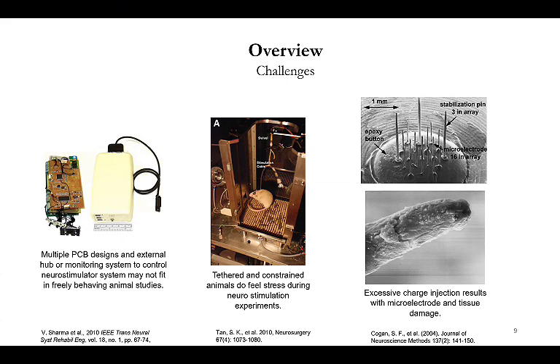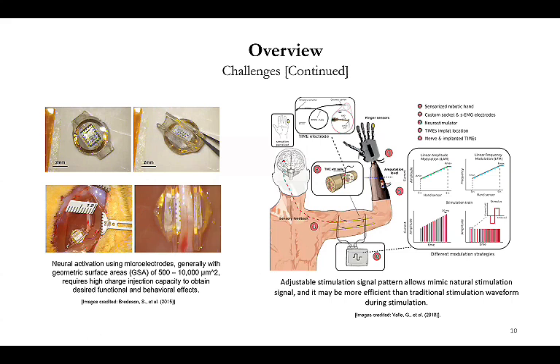So the other one is on the last study, it's another application. We use microelectrode array for high charge injection capacity, but at the same time, we need to increase some certain limits. So in that case, we will do another technique to solve this problem, because eventually our purpose is to activate the nerves, but we hit some certain limits for the charge injection capacity, but we need to solve this challenge to inject more charge.